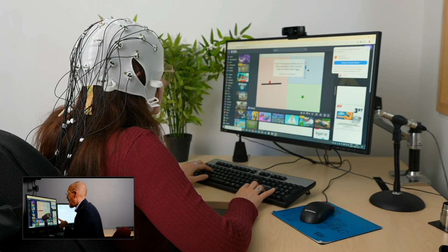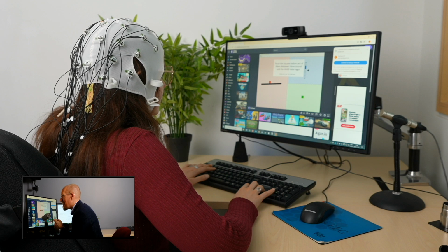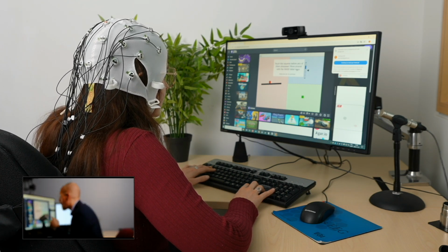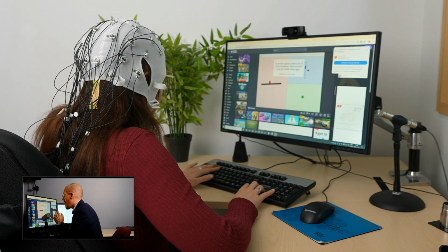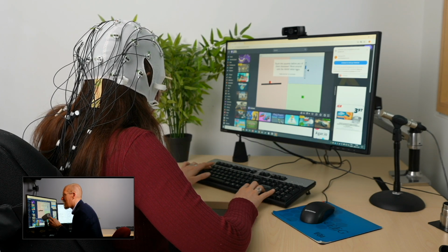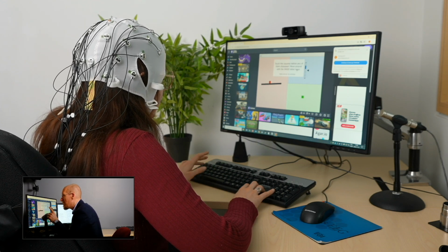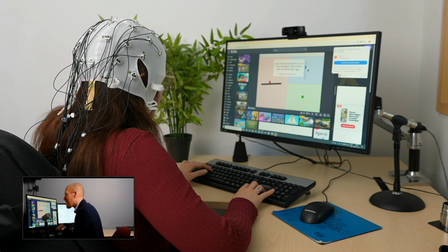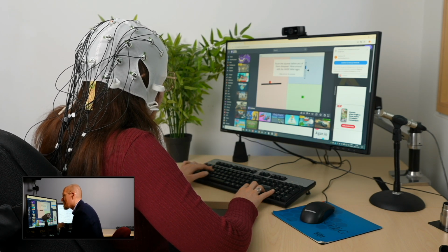So Anne, now we have 3 things to keep track of. You have the left and right arrow for the ball. You have up arrow and down arrow for the blue cursor. And you must use your left hand, okay? Yes. On the W and the A and the S and the D, okay? W is for up. Okay. S is for down. A is for left. D is for right.